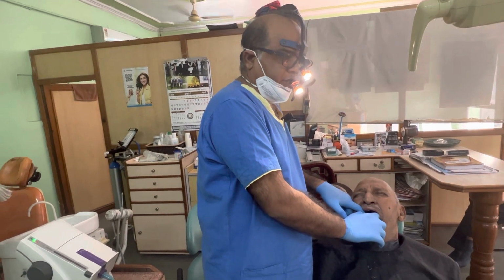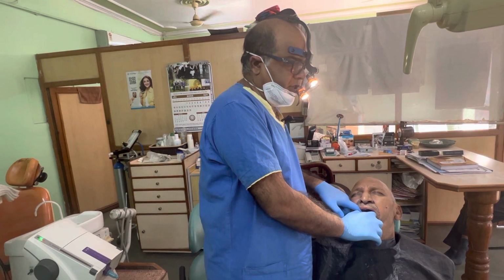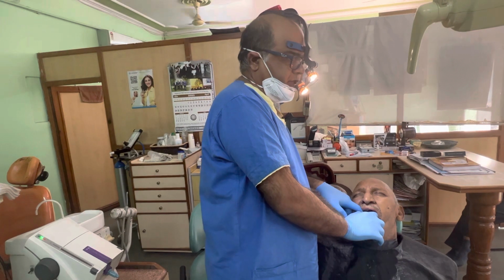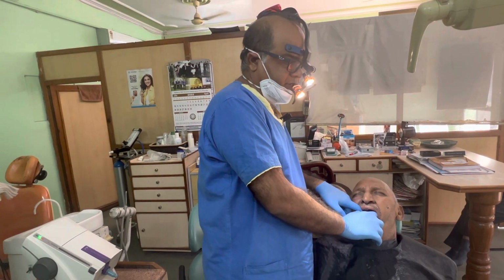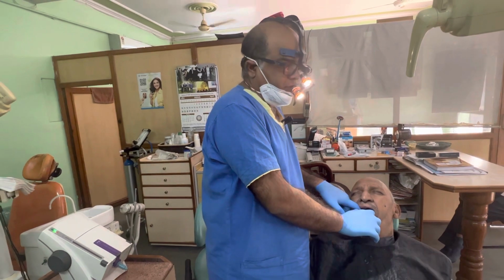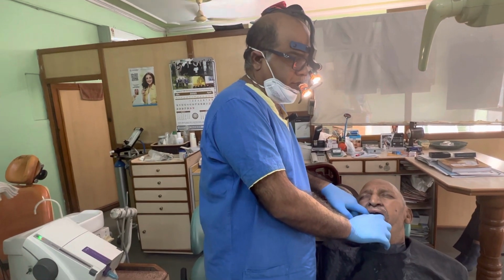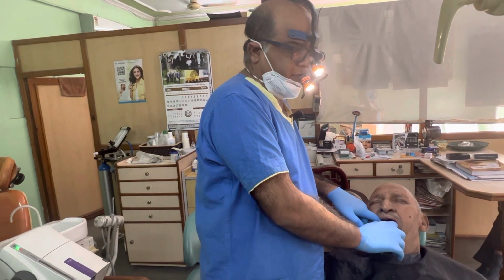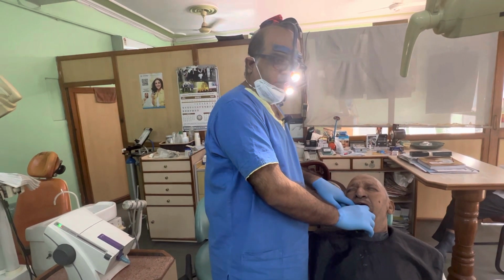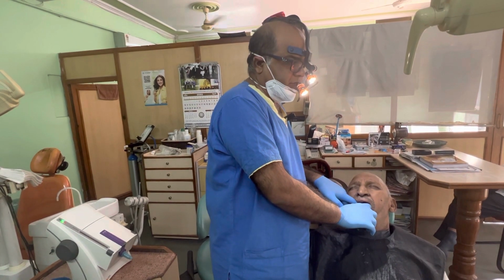Second important thing, you have to check the tray multiple times in the patient's mouth, whether there are any hindrances, any blanching, any soft tissue impingement. Okay, then clean the area. You have to do a superficial scaling in this condition before making any impression.